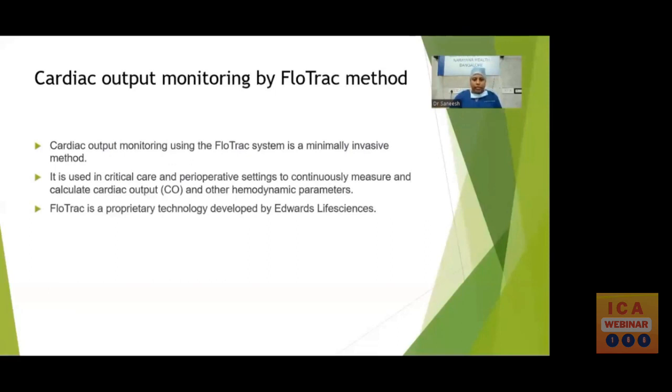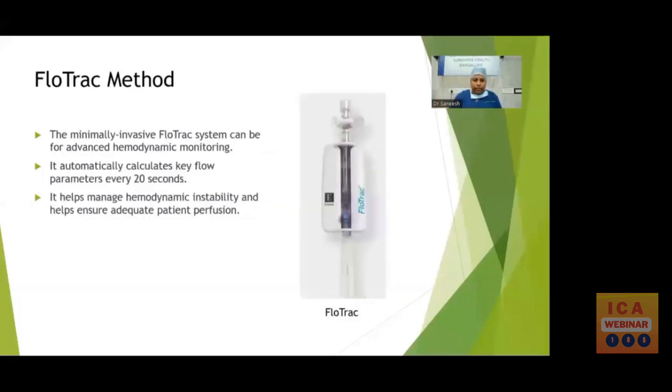Cardiac output monitoring using the FloTrac system is a minimally invasive method. It is used in critical care and perioperative settings to continuously measure and calculate cardiac output and other hemodynamic parameters. FloTrac is a proprietary technology developed by Edwards Lifesciences. The minimally invasive FloTrac system can be used for advanced hemodynamic monitoring. It automatically calculates key flow parameters every 20 seconds. It helps manage hemodynamic instability and helps ensure adequate patient perfusion.